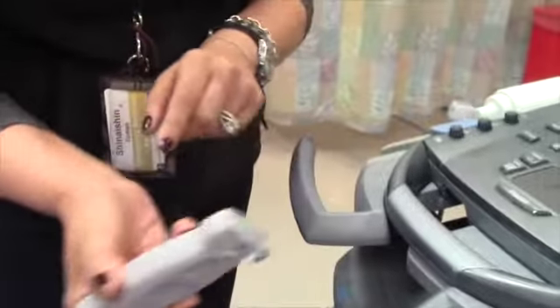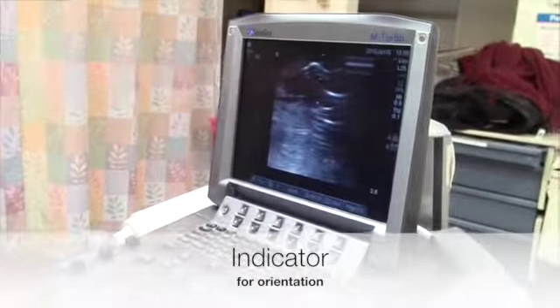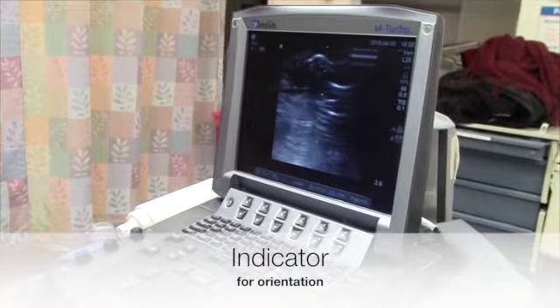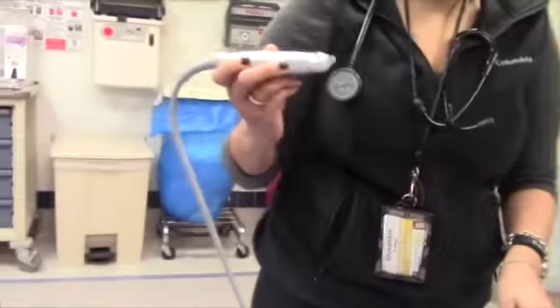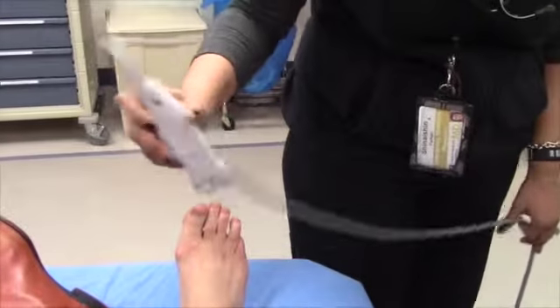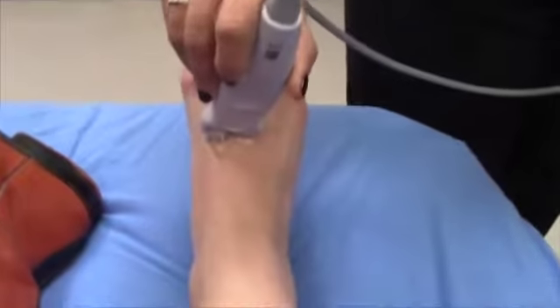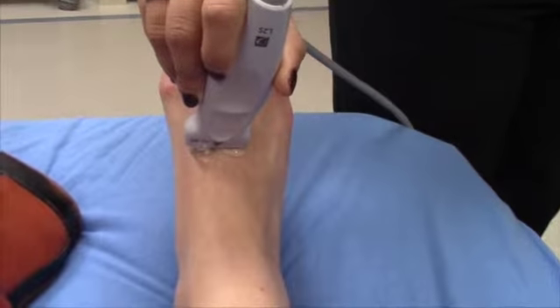So when you're using the probe, you always want to line up. There's always a little ridge on one side of it. That should be lined up with the blue dot on the screen so that you know your orientation is correct. Okay. So a little bit of goop on the probe. Okay. And I'm going to change the depth a little bit.